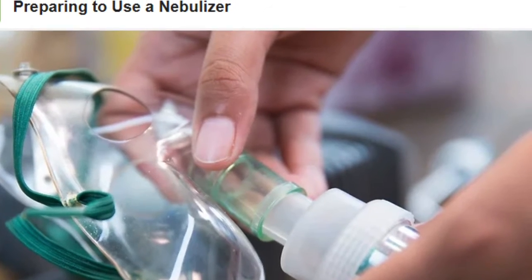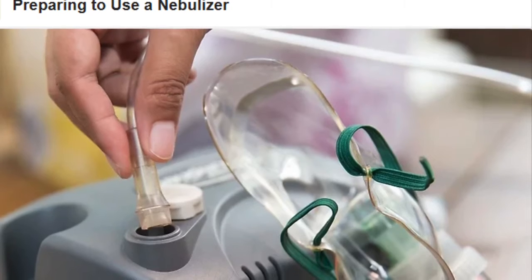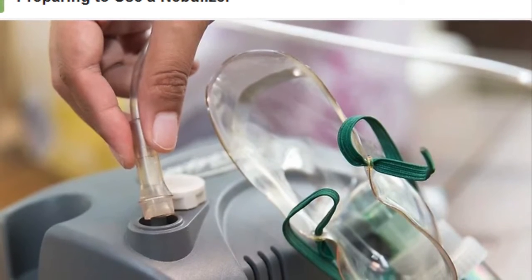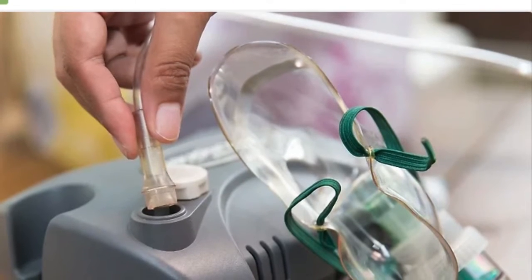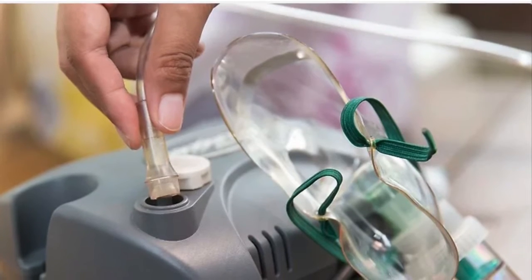The fourth one is to connect the tubing. Attach one end of the oxygen tubing to the nebulizer cup. On most types of nebulizers, the tubing will connect on the bottom of the cup. Connect the other end of the tubing to an air compressor used for nebulizers.